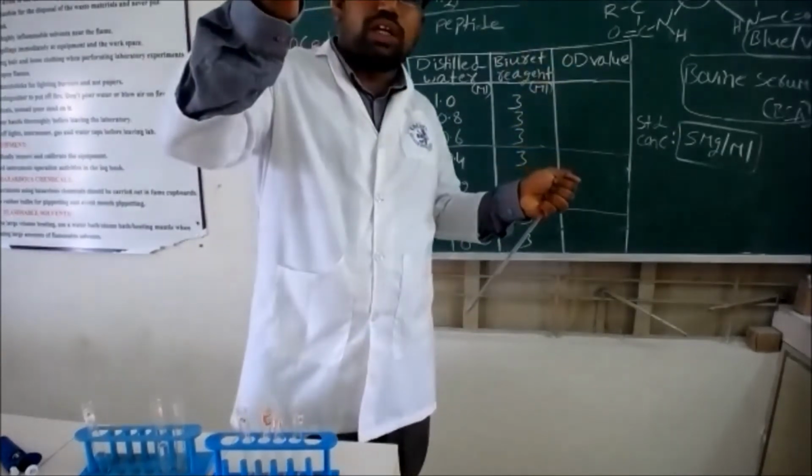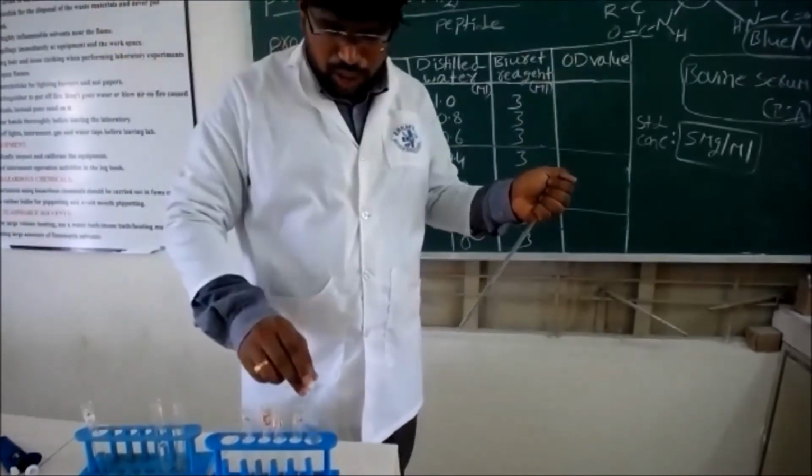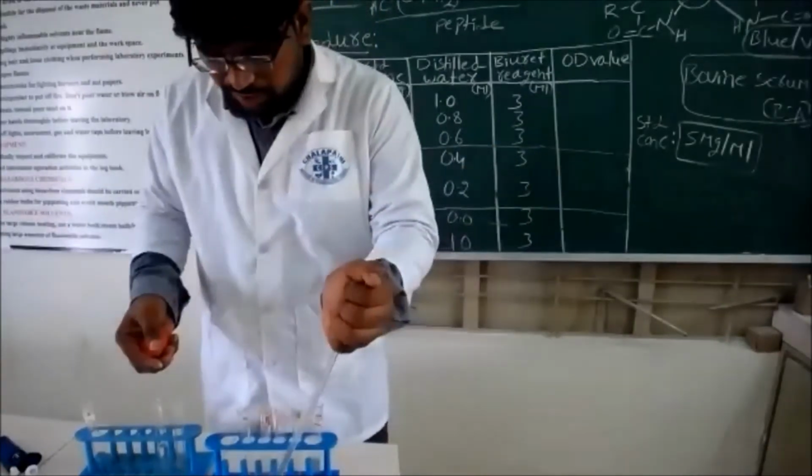Now you can observe the reaction slowly happening. Slowly the color change is visible. After 2 more minutes you can get the clear change.